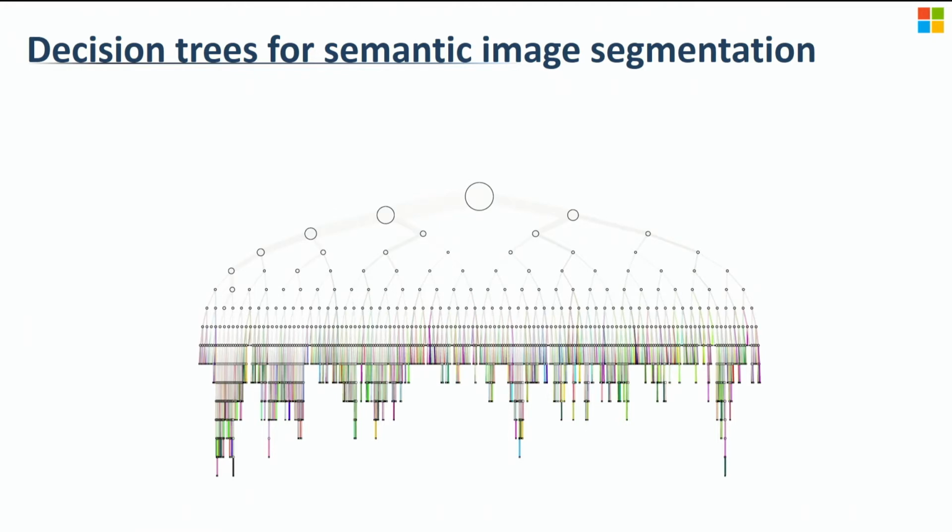So you have this decision tree, right? And the idea of a decision tree is that at each node you train a very simple classifier that tries to maximize the purity of the classes. So all the training points, all the voxels, get into one node, and then you try to figure out how to split them into parts so that the voxels that probably belong to one type of data go to the left node and another goes to the right node, and that process happens over and over and over. And further down the tree, you end up having to split between voxels that more likely belong to a bladder or voxels that more likely belong to a prostate. And at the very end, you have very pure classes. This is how decision trees work.